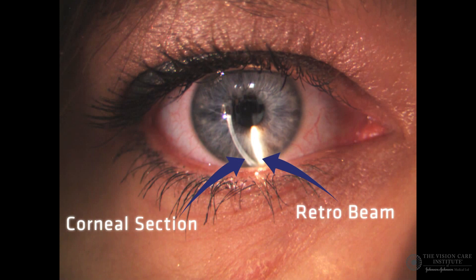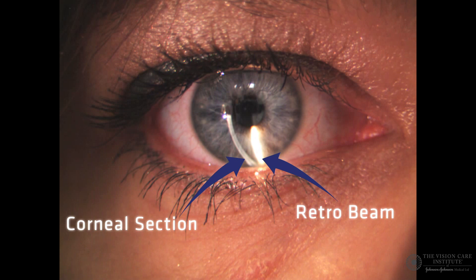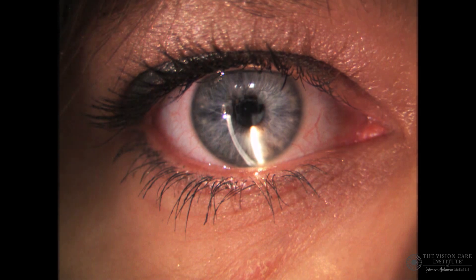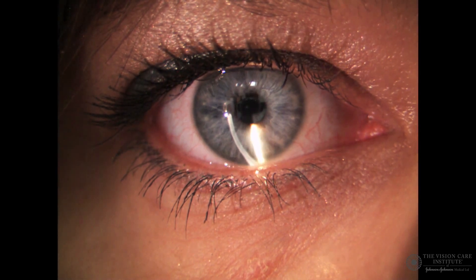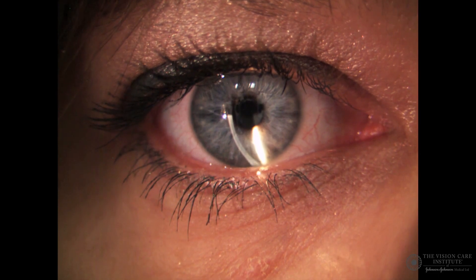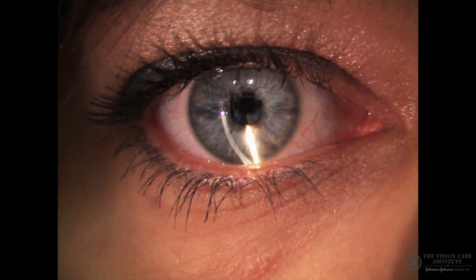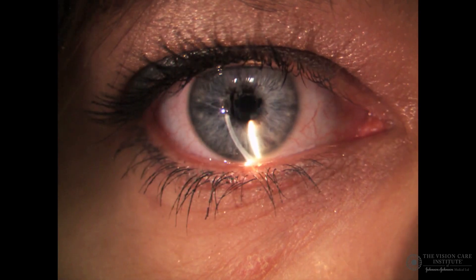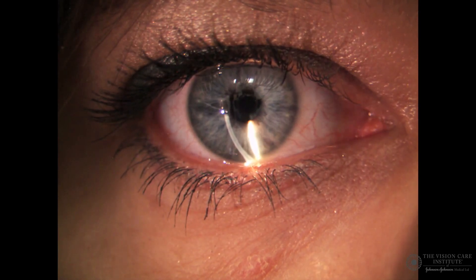In this image, we can see the corneal section formed with a direct beam on the left, and the retro beam is formed by the light that goes through the cornea and is diffusely reflected back. We will need to position the retro beam below the structures that we want to look at, so the beam on the right is the retro beam and we want to look at structures that are above the beam.